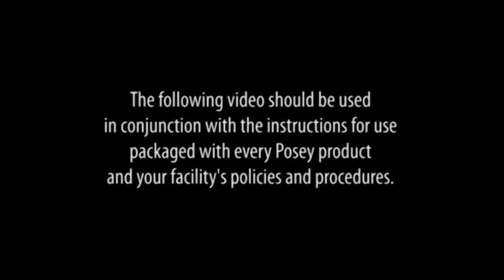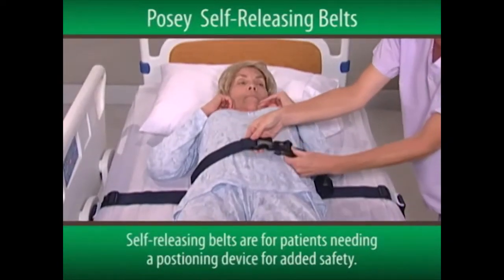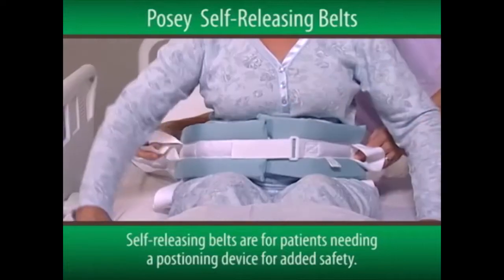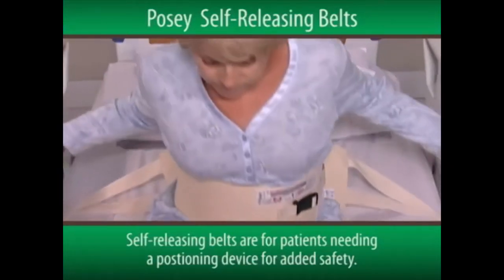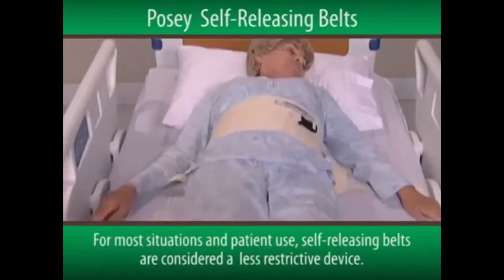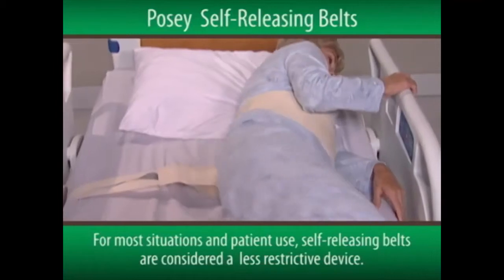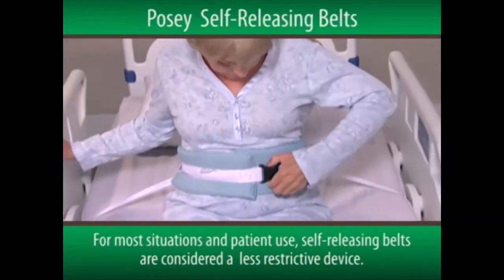The following video should be used in conjunction with the instructions for use packaged with every Posey product and your facility's policies and procedures. The Posey self-releasing belts are for patients needing a positioning device for added safety or those needing a reminder to call for assistance before exiting a bed. For most situations in patient use, self-releasing belts are considered a less restrictive device and should be tried before other, more restrictive methods are employed.